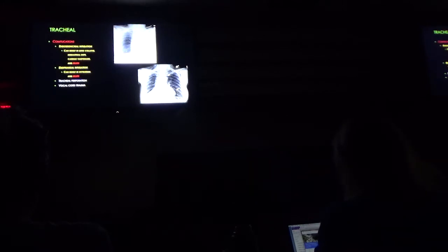And then confirmation with capnography, pH paper on that square thing, and I know they showed that to you during ACLS. Depends on where you're going to be practicing and where you're rotating on whether they use that or if they just use that capnography wave thing. But know the colors of that pH paper and what that means and when to troubleshoot that. Okay.